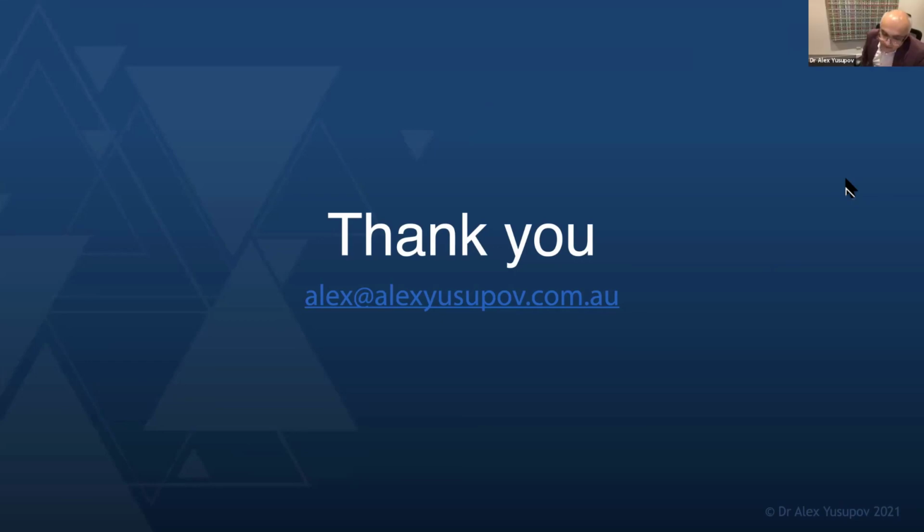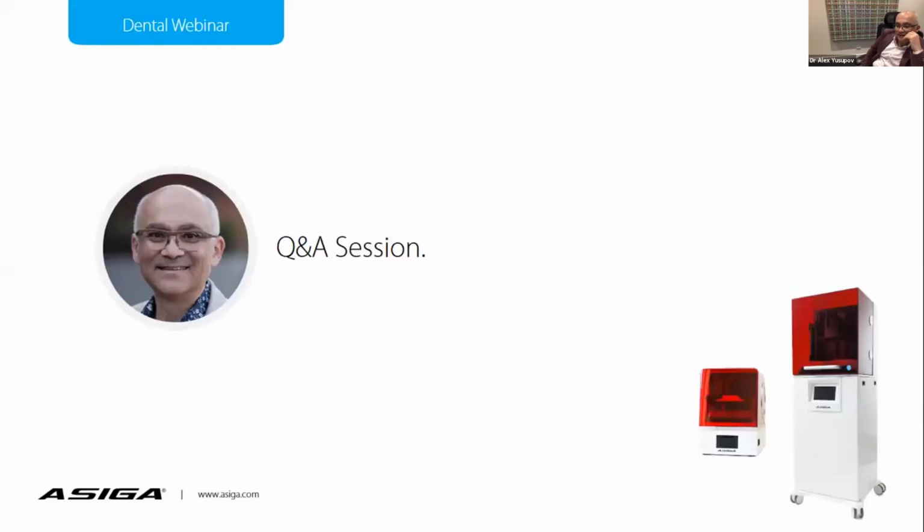All right, the 3Shape is used pretty much for every model, because it's done by one of my staff. She's the same girl that prepares all my photographs. So basically, she will base the models, but my laboratory girl will only use Netfabb, because then she will cut that model further into what she wants. And we also use Netfabb to do some minor repositioning. It's just easier than using 3Shape software to section the teeth. So I basically pretend that I'm using a little plaster saw to cut the teeth and move them, and my lab girl does it by herself.